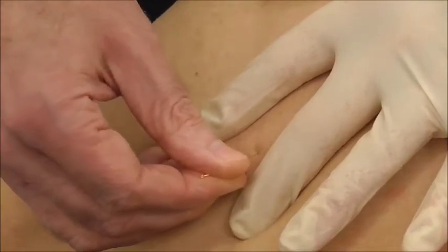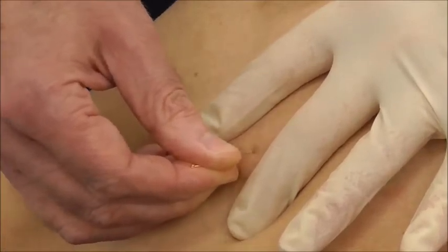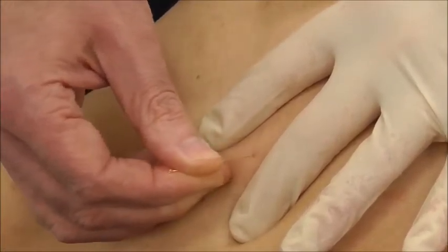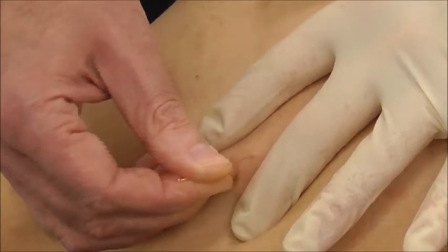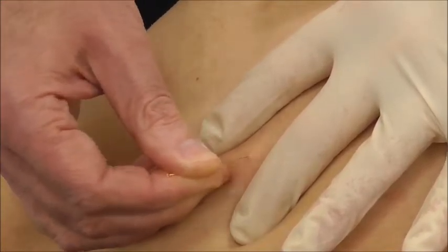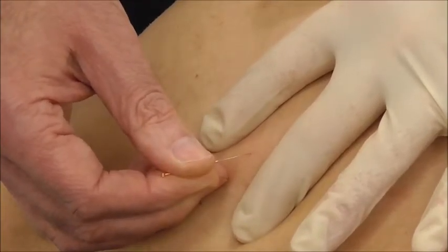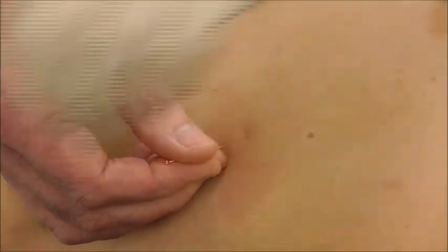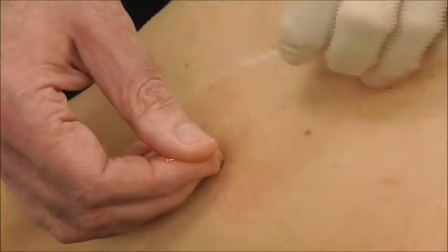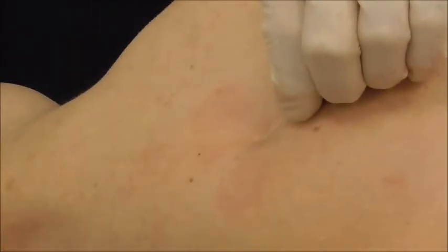I'm coming through the trapezius into the supraspinatus, making sure I'm not going down towards the couch — that would be a vertical insertion. I maintain my oblique insertion angling from the skin. I keep compression on as I withdraw the needle, and just before the needle tip breaks free of the skin surface, I compress the skin with a tube to stop it gathering around the needle. Then I inspect the area — if there's a spot of blood, I compress it.